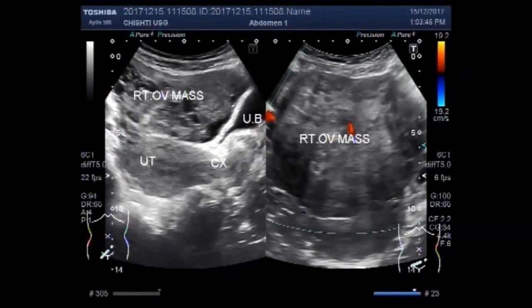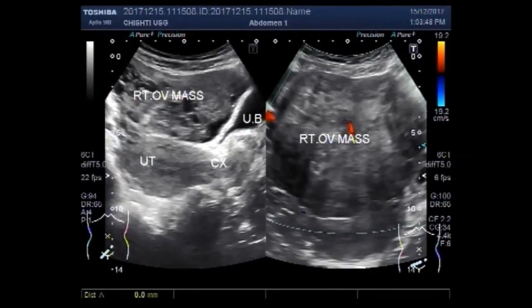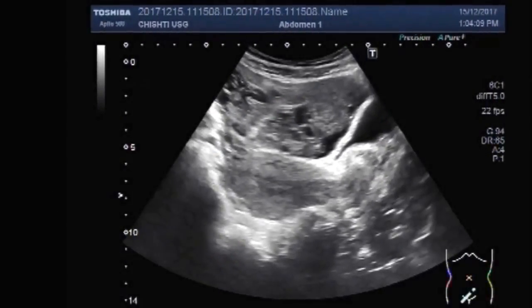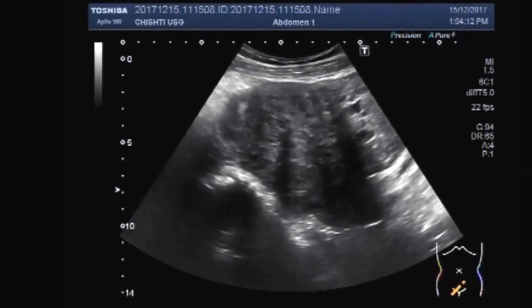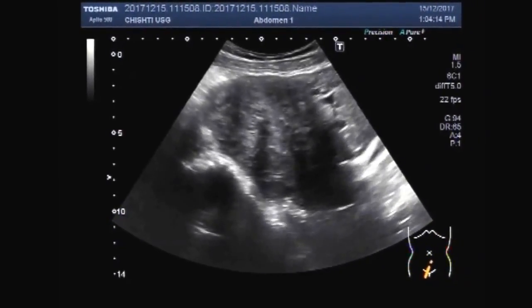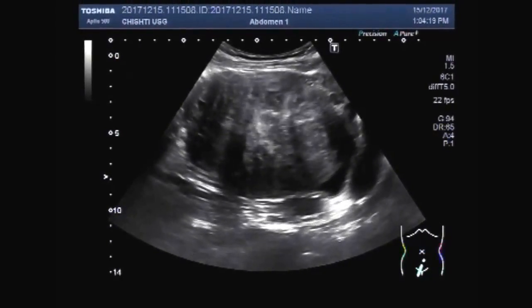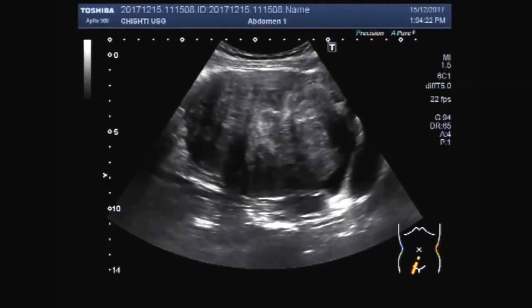Dear viewers, I hope you are all fine. This ultrasound video shows a large ovarian mass. You can see it is 10.8 cm by 10.6 cm — a large right ovarian mass.